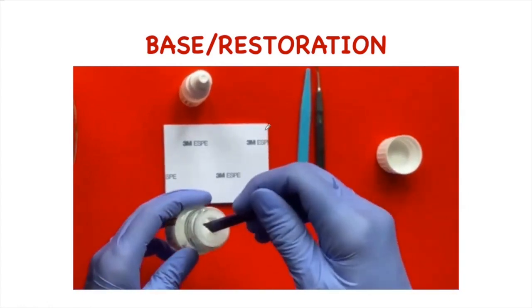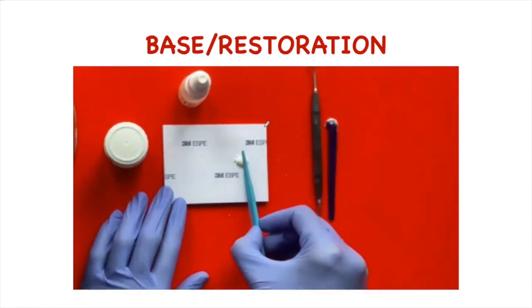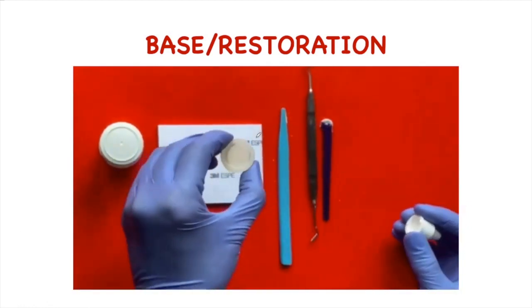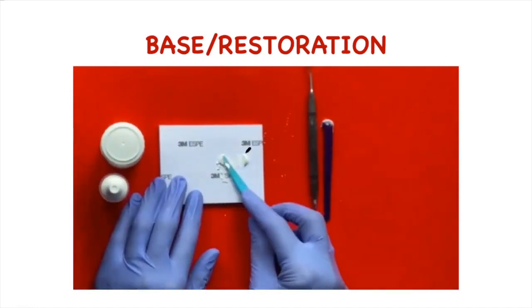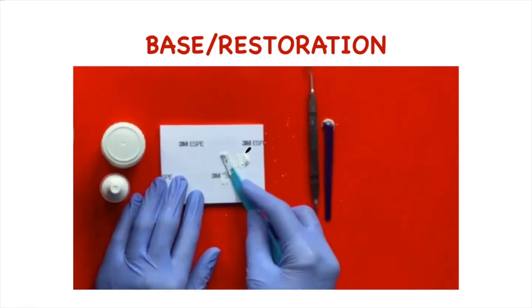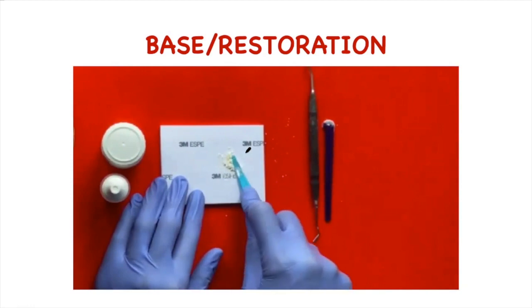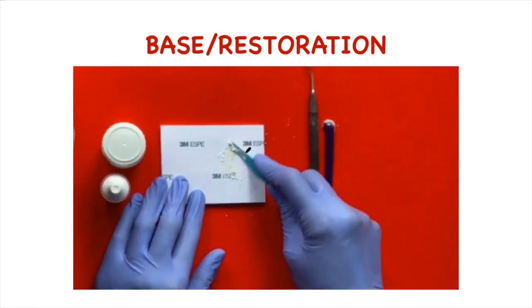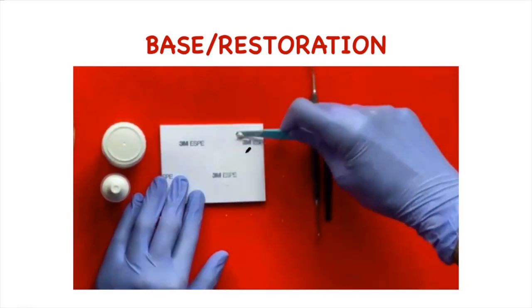We take one scoop of the glass ionomer powder and divide it into two equal halves. Then we take the liquid, and keeping the bottle vertical, dispense a drop of the liquid. The first increment is mixed for 10 to 15 seconds in a rapidly folding motion. After this, we take the second part, which is also mixed for 15 to 20 seconds in folding motion. This is how we mix the glass ionomer cement.